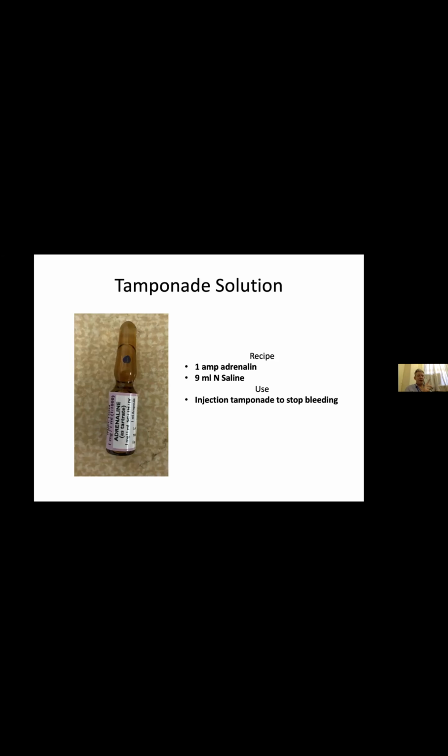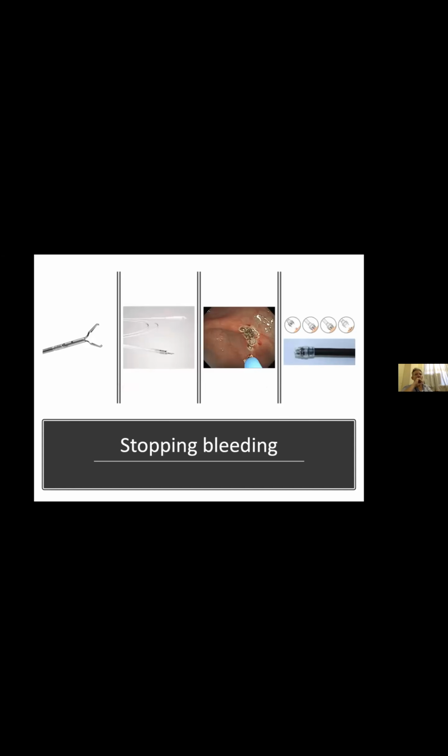And so you have this bleeding vessel that you could see beautifully and place a clip on. You tamponade it because you've got it quick and easy at hand. And now you're trying to clip a vessel afterwards that's at the bottom of a pit. So generally, if I'm going to use a clip, I use a clip. I don't use adrenaline. Usually I use adrenaline if it's a very minor bleed, a little bit of an ooze that I'm slightly worried about. And honestly, probably doesn't need anything. So these are the things we can use to stop bleeding.